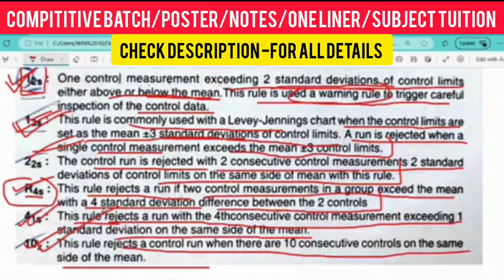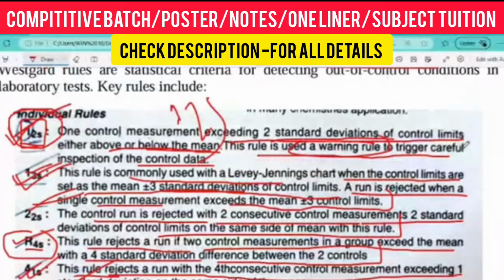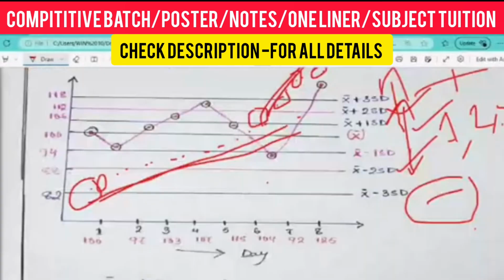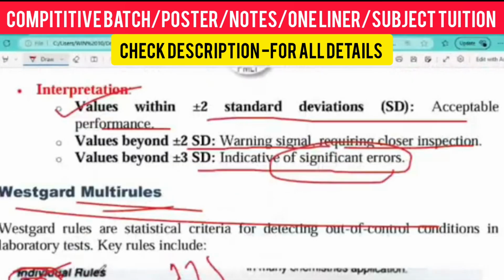Is it too tough? No, it's easy. Are you understanding? So we can only accept one result, that is only 1 2s. Otherwise, we have to reject the whole result. Your procedure should be: run the sample, make the Levey-Jennings chart, and match it with the Westgard rules. Nowadays this is not required manually. The machine gives you the Levey-Jennings chart and you just match it with the Westgard rules.